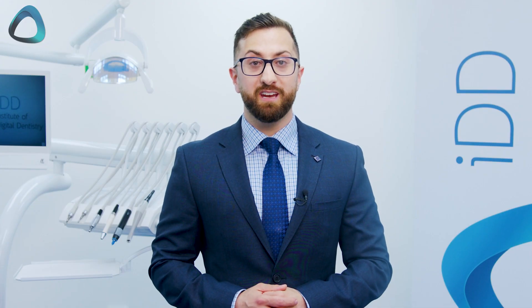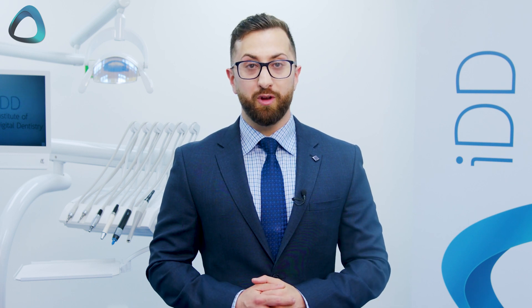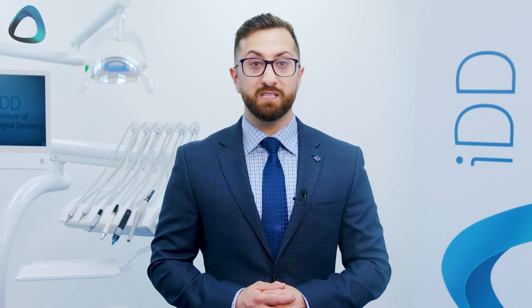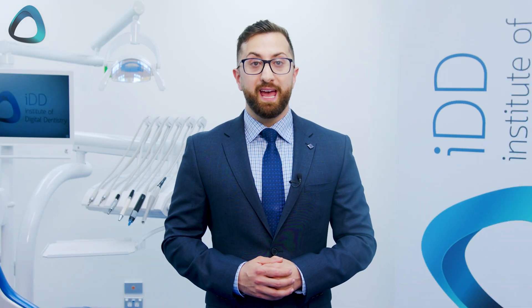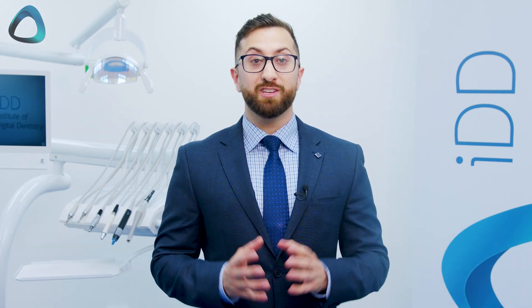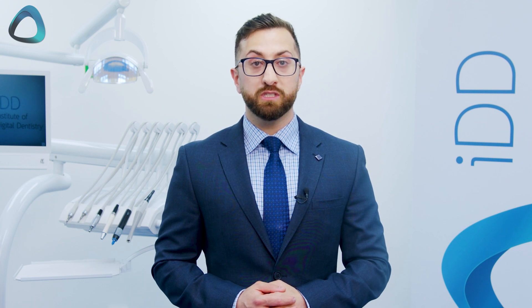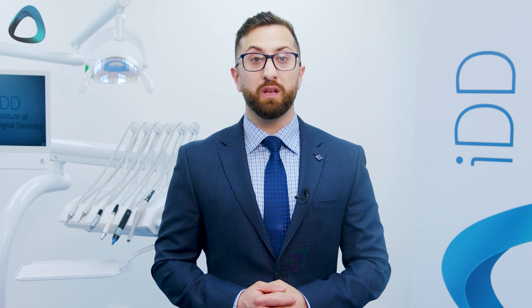I first saw this scanner at the International Dental Show in Germany three years ago. Straumann has sent me this 2022 version of the scanner because a lot has changed since its release in 2019. There have been several software improvements and an entirely new relaunch and repositioning of the scanner. Straumann is confident they can make this scanner succeed globally due to recent growth and positive user feedback, even though back in 2019 it saw limited success.